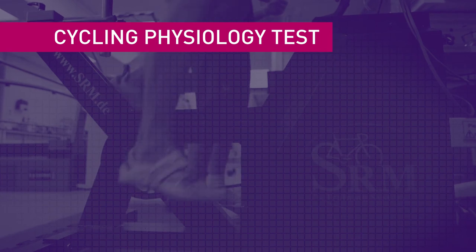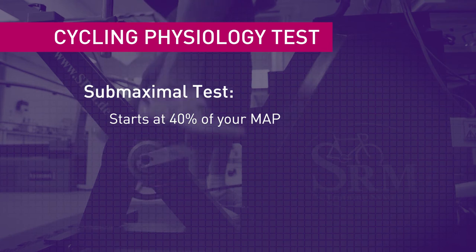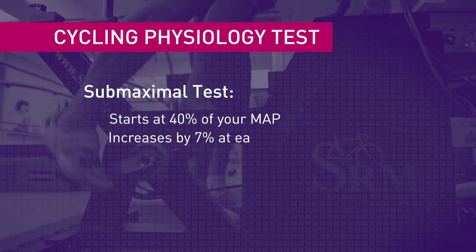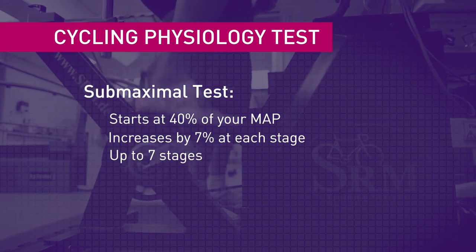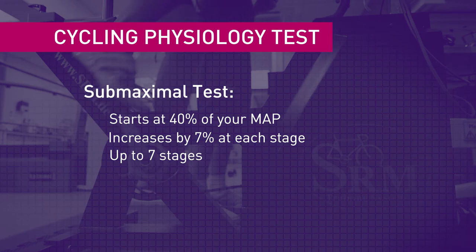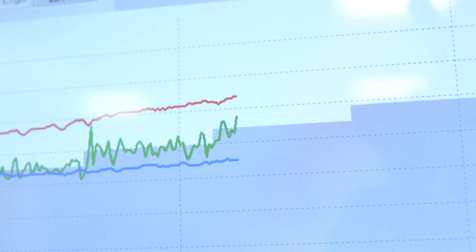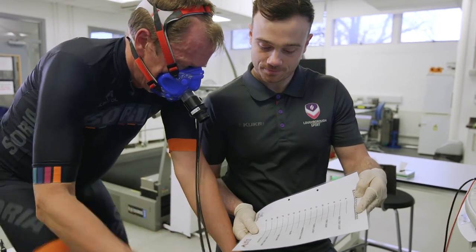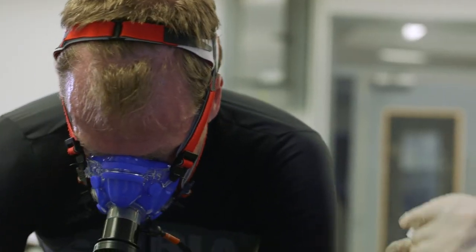The second part is the sub-maximal test. You will start off at 40% of your maximal power output achieved in the max test, and it will go up by 7% each stage after that. There are up to seven stages, and if you complete all seven you'd be finishing on 82% of your max power. Starting off nice and easy and finishing fairly hard, at the end of each stage we would ask you to tell us how hard you felt that stage was — your rating of perceived exertion — and we would also take a small blood sample from the earlobe.